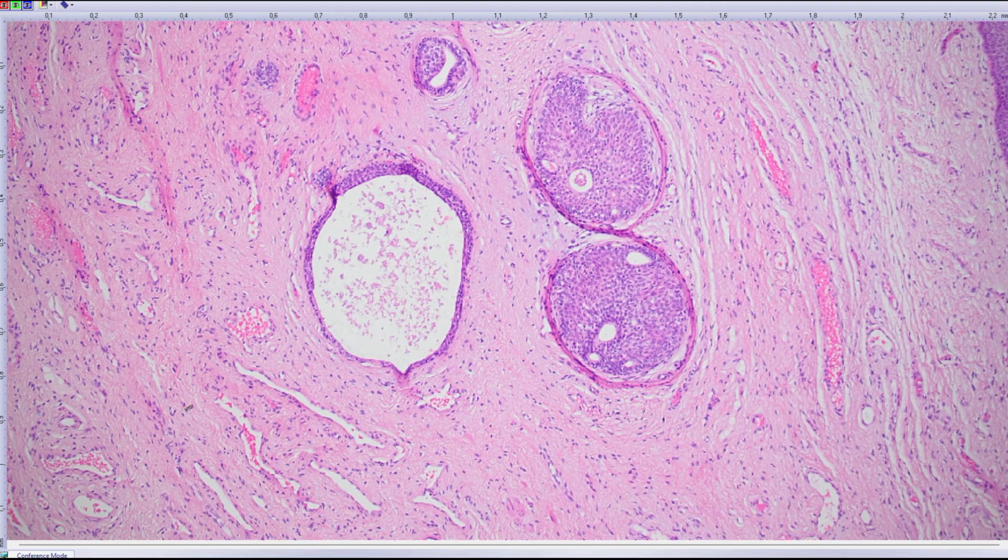This doesn't have anything to do with Skene glands. Just quite a lot of lesions, and we have maybe 20 of them in vulva and vagina, are having glands that are prostatic markers positive. That means it's not that rare in women.